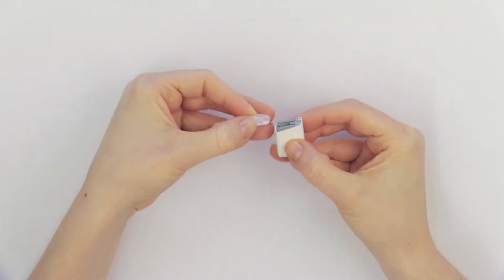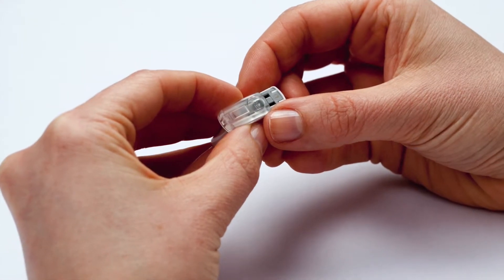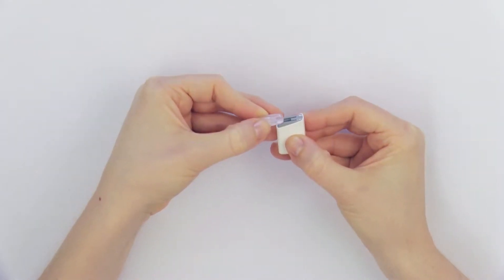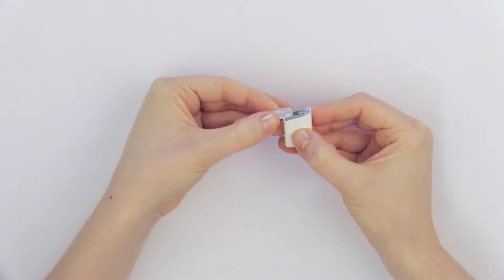To replace the PowerCell cover, hold the PowerCell with one hand and align the cover with the PowerCell rails. Slide the cover onto the PowerCell until you feel it click into place.